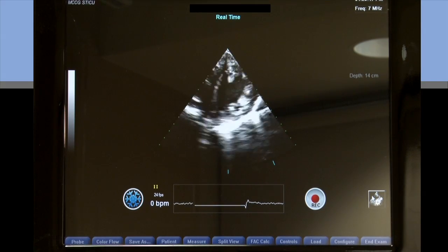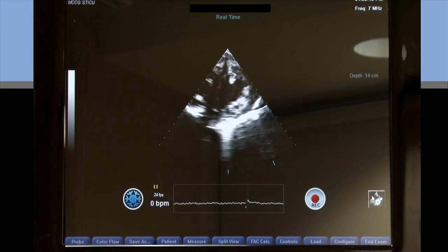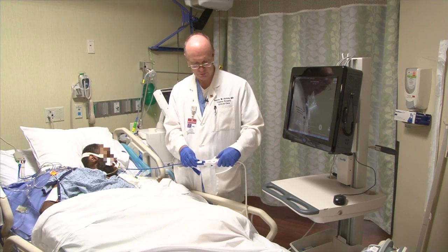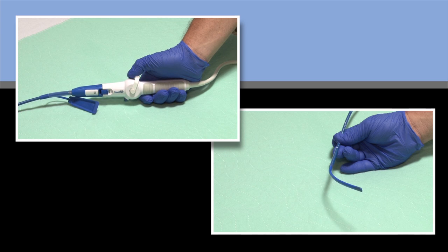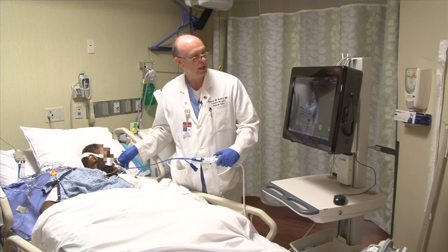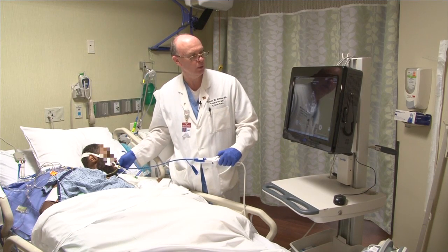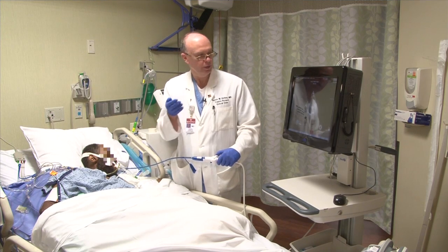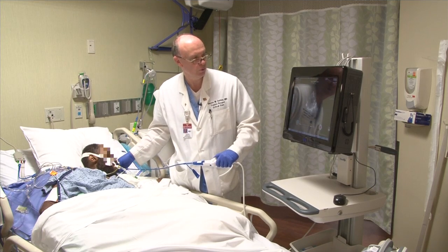There's really not too bad an image here of the left ventricle, but once I get in position and I start to see that movement or contraction, I'm going to anaflex, which is toward the back end of the handle away from the probe. My thumb will move in this direction to try to bring that left ventricle in — really cupping that ventricle through the stomach so that the ultrasound probe can be in contact with the heart through the diaphragm or through the stomach.